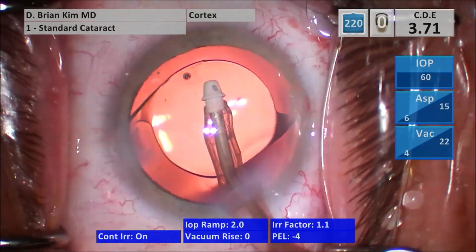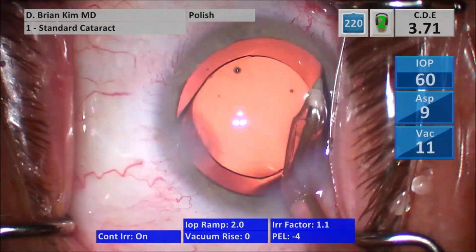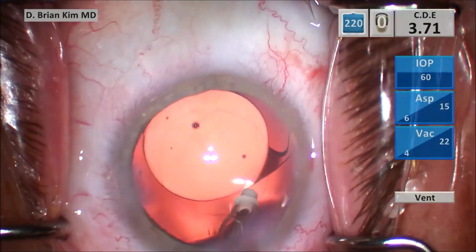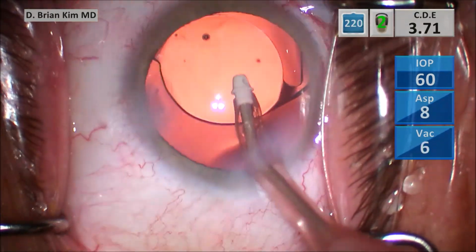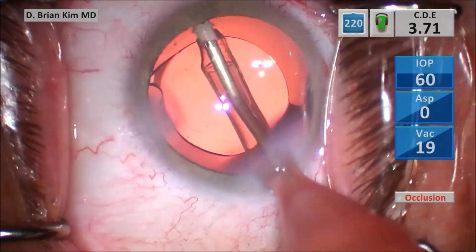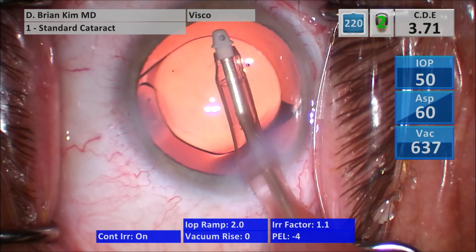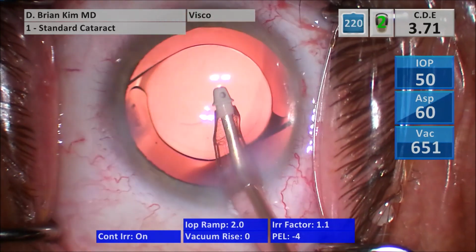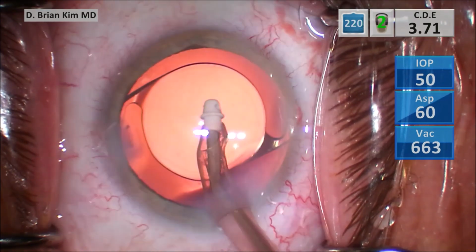Switch to polish mode, polishing underneath the rexis edge. Getting underneath the lens again, I saw some fine lens material, and that's why I'm going after that again. Polishing some more, and then go to visco mode, and then I'll hydrate my incisions, and that'll be the end of the case. So again, double chop is all about having two instruments to crush the lens.